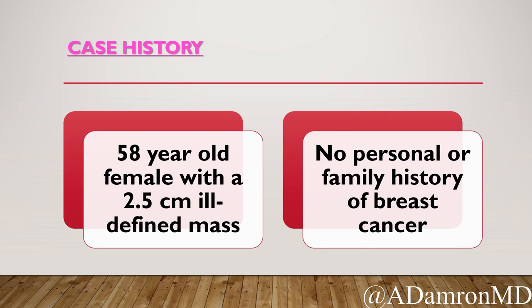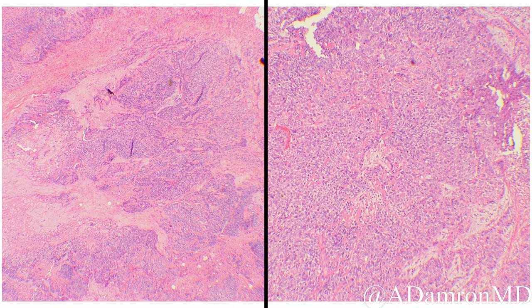The lesion was biopsied, called something that needed to be excised, and we're going right to the excision. On low power, we don't really have our normal breast structures here - this is really just an infiltrative epithelial-looking cell population within the stroma. We don't see any normal architecture or normal breast tissue. Going to higher power, these cells have a basaloid appearance, very solid, and on low power we're seeing some matrix production by this tumor.